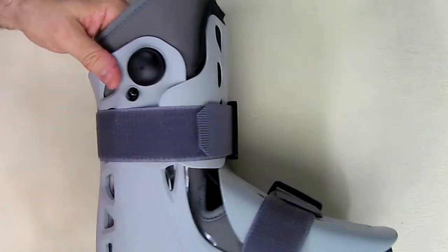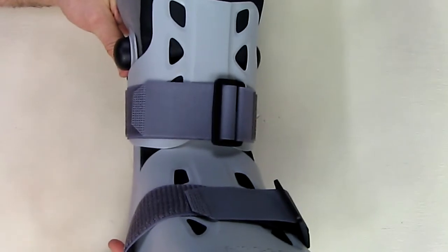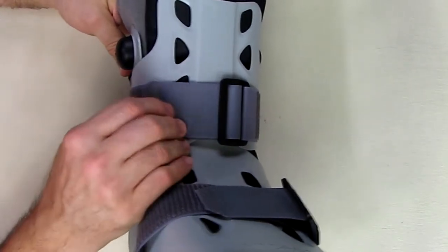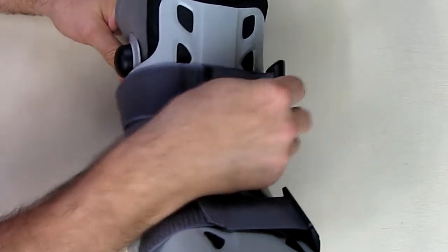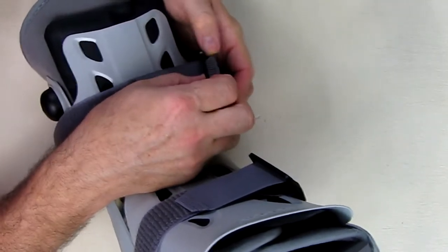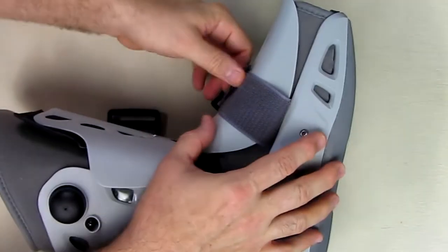Now I'm going to show you a demonstration of how to put this on, and I'll also show a video from the company. Right here I'm going to take the Velcro off so we can get to the inside of this and show you the ports so you get an idea of how they operate. I'm going to take the boot plastic off.